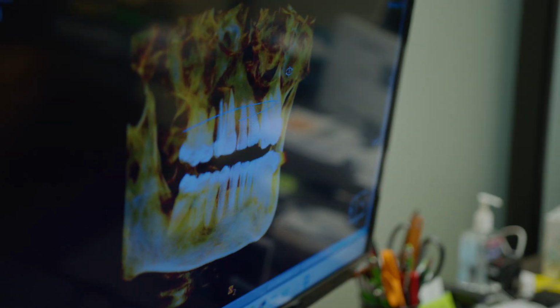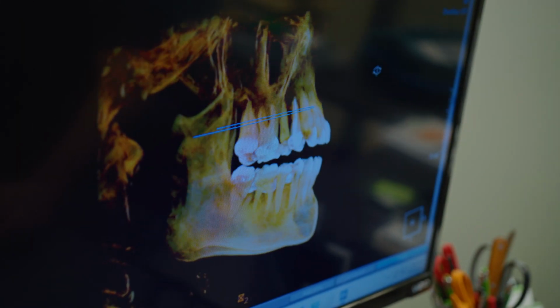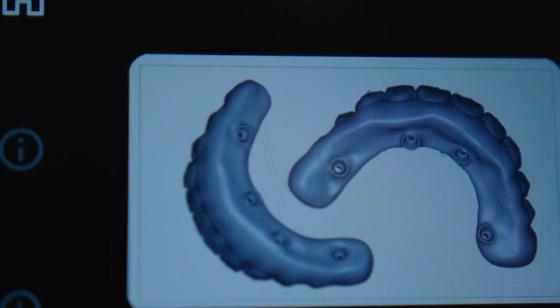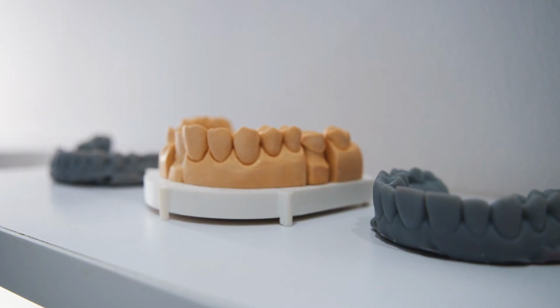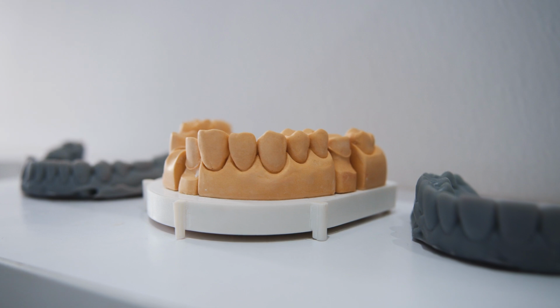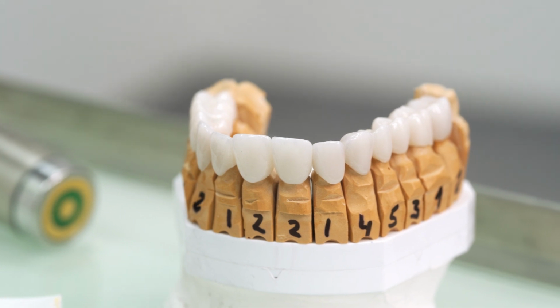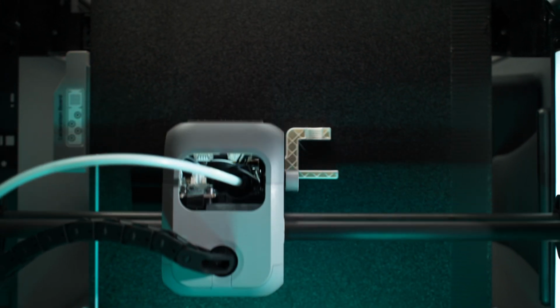You know, when we first started doing this whole digital dentistry, implant dentistry journey, companies like 3Shape, Sirona, they used to either lock the data or charge you to export your data. And I had told them 7 to 10 years ago, don't do this. This is not the way the industry is going. And you can see it now from closed printing systems are now completely open because they want the user to be able to use whatever resin they want, whatever software they want in some sort of capacity, but more importantly to be able to say, I believe in this resin, I believe in this aesthetics, I believe in this strength, I just want a printer to be able to print it.